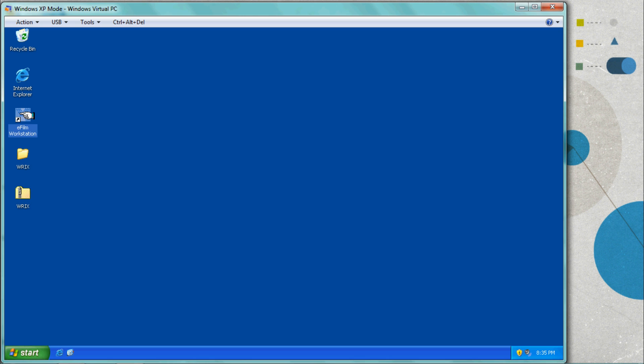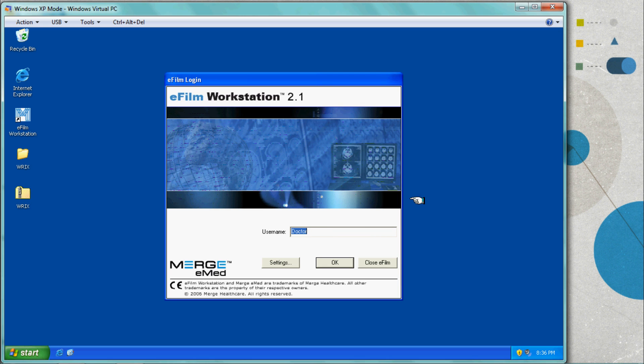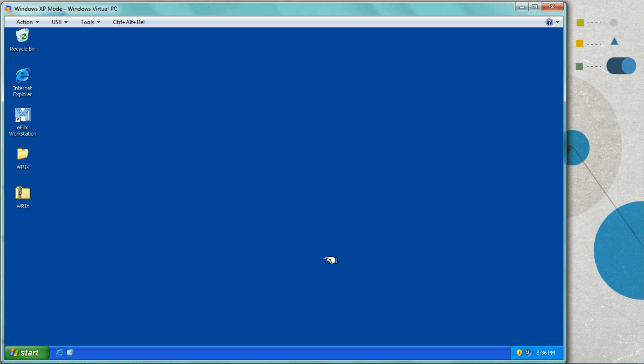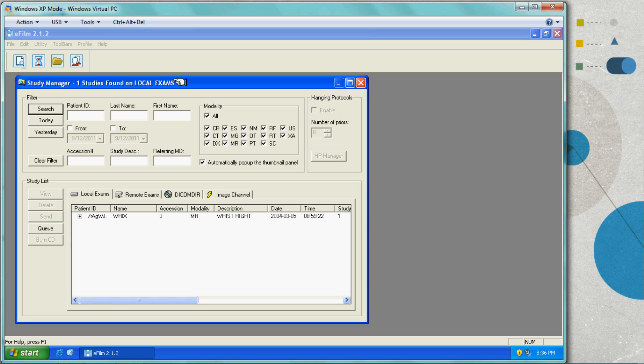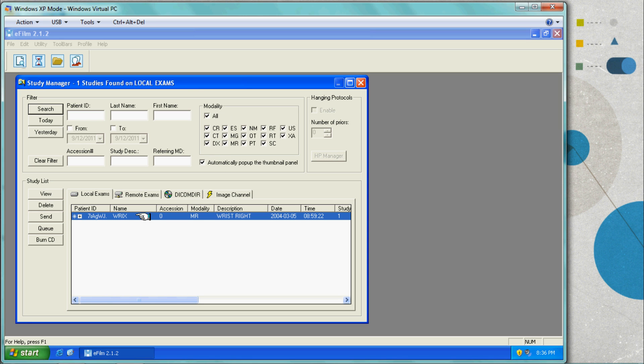Thank you for joining us for the demonstration of Webflow Online integrated with eFilm. The user logs in with their username and they will open their study.